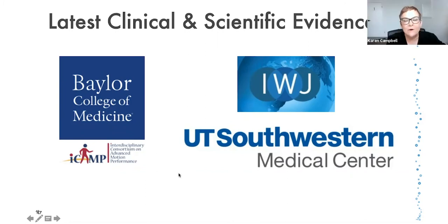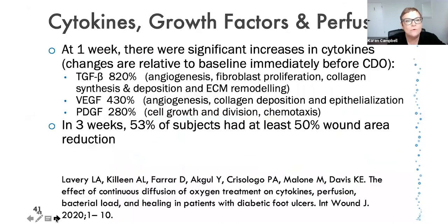Thank you, Kathy. Now it's Karen back, and I'm going to be talking about some really exciting clinical evidence that's developing and a few studies I'm going to review with you. So the first study that I want to talk about is a study that looked at cytokines, growth factors, and perfusion. And you can see the reference here if you would like to get the full paper. It's published in the International Wound Journal.